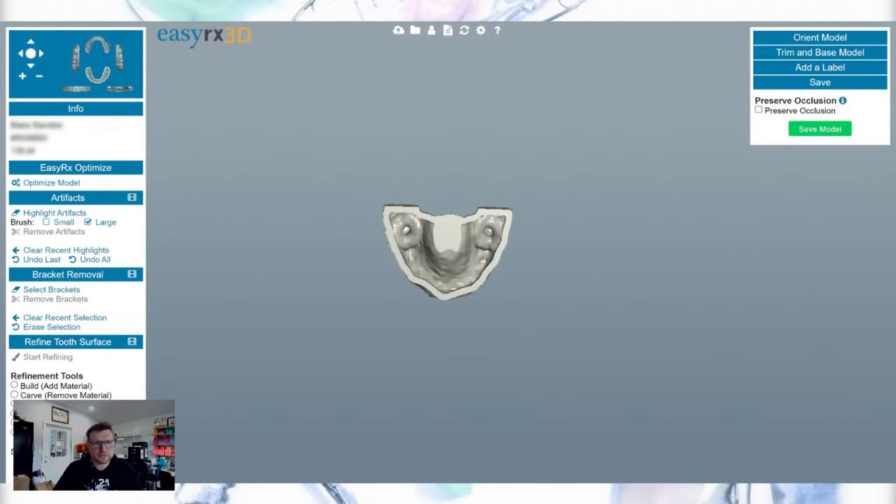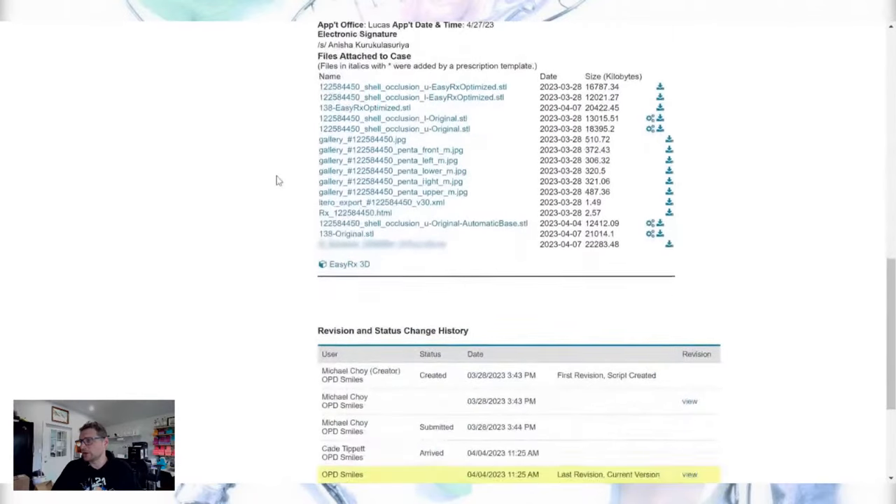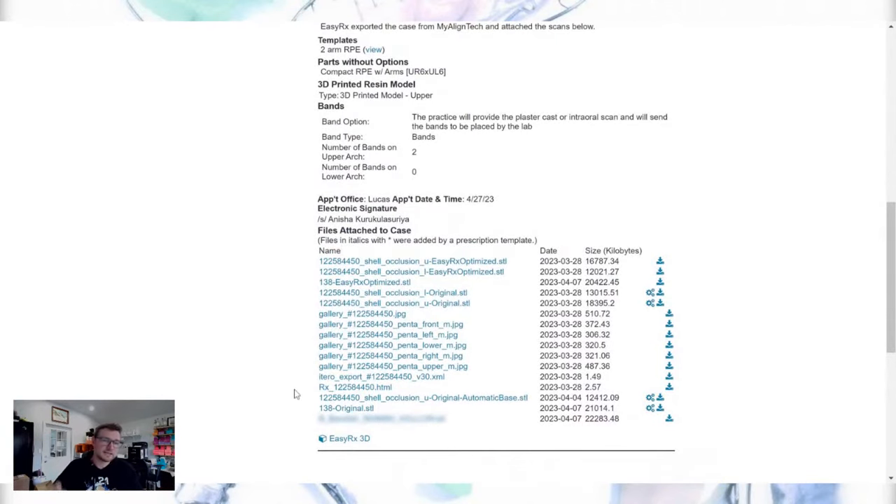Back in EasyRx, once you save the model it automatically saves back to the prescription. If I go back to the prescription and scroll down, it's right there. Then I can immediately go into printing — there's a full two-hour digital workflow video that shows how it gets saved into a print list in EasyRx. I click all the models I want to print, hit the button to send to my nesting software for the 3D printer, and it downloads without ever saving to my computer's hard drive.